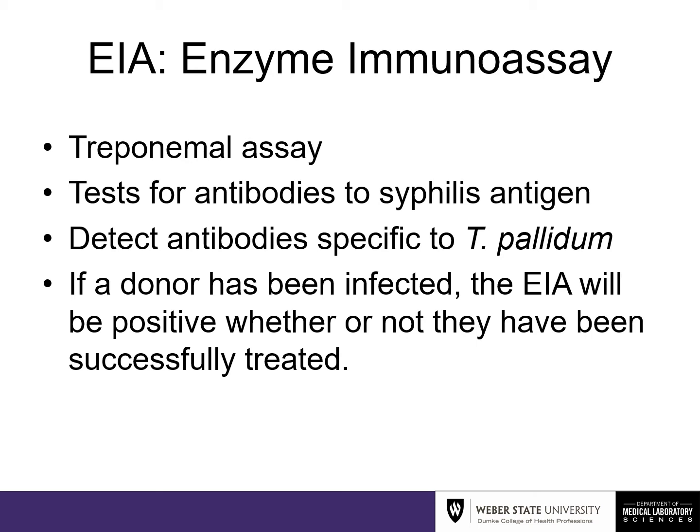So the RPR kind of helps with once they have been successfully treated after 1 to 2 years, then they'll be non-reactive. And then at that point they won't have to have the confirmatory. So it's kind of nice and better to do the RPR before you do the EIA or the treponemal assay, because whether or not they still have syphilis, the treponemal will say they have it. So in that case you could get a false positive.